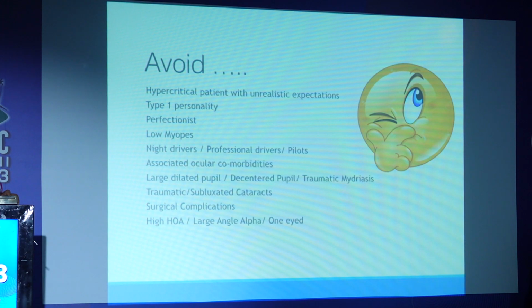Any kind of surgical complications that we have intraoperatively, I think we should not have any ego there, and we should always discuss with the patient on the table, and we should always have an alternative scenario. We've seen a lot of patients having lenses dislocated, not on the axis, and patients complaining of glare, or vitreous in the anterior chamber. I think this is a big no. If you have an open bag and the lens getting decentered, I think the ego should not come in front, and these patients should not be taken on these kinds of IOL platforms.